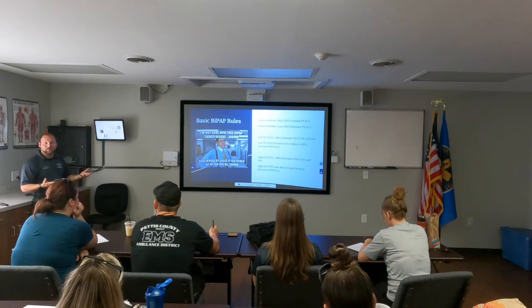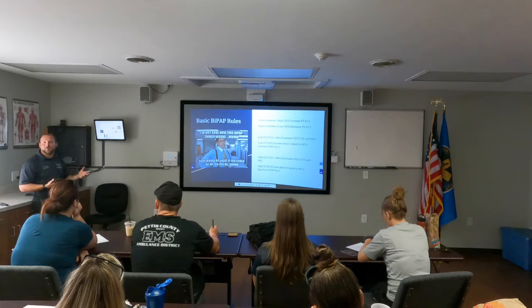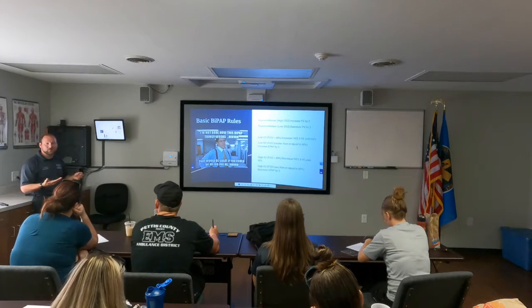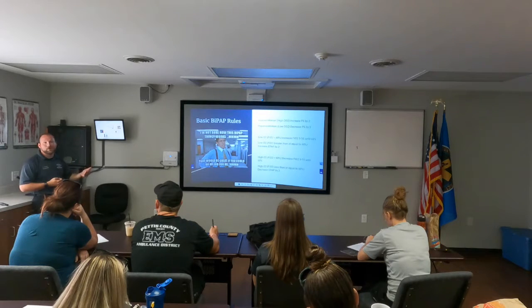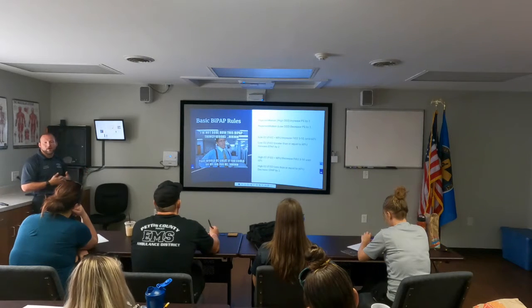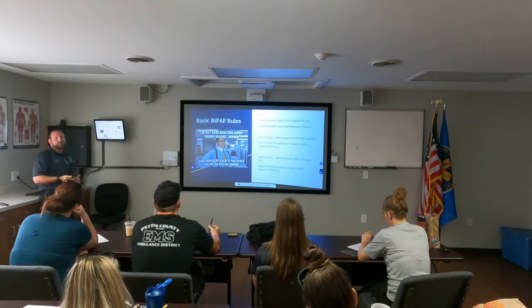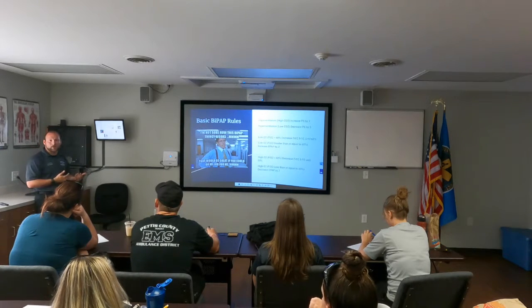Again, in the field, like we said, we talked about your initial BiPAP settings, either 10 over 5 or 15 over 5. FiO2, start at 60 and work your way up from there. You can start at 100 if you choose to. Just know that you will have to be backing off on the FiO2 at some point once you know the patient is comfortable and stable with what they've got going on.